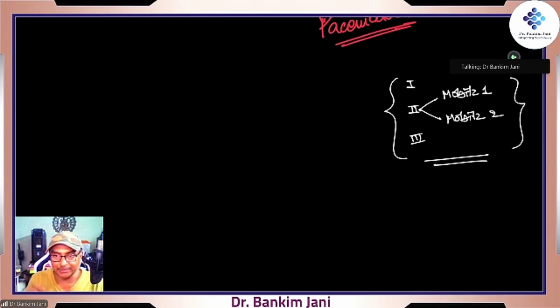I'll put into our shared notes some ECGs for practice. Not every ECG will show a block, and we don't use atropine in type 3. So you'll find that at times some of the ECGs will be normal also. I'll be putting a combination, multiple ECGs.